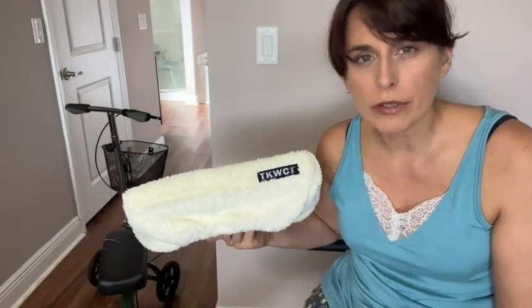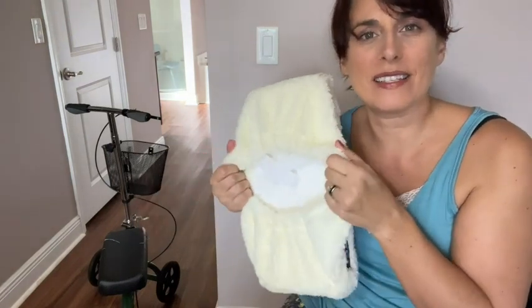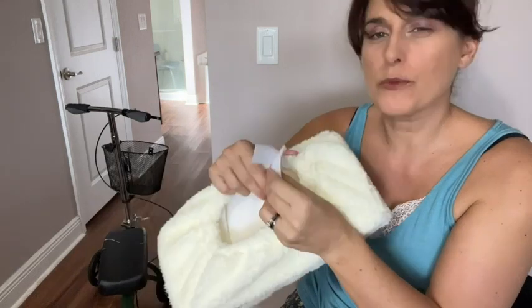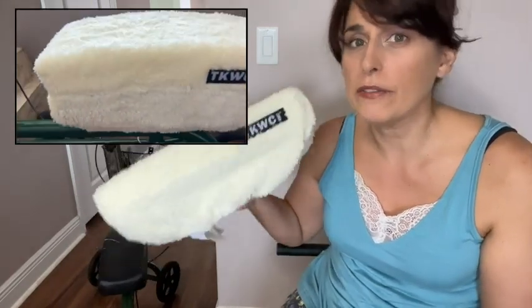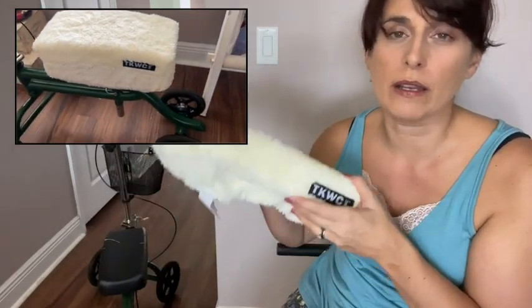I was concerned while using the knee scooter that I wouldn't feel as stable when I added an extra cushion on top. I'm happy to say that because this is such a snug fit and it comes with those extra velcro pieces, I felt very secure and stable while operating the knee scooter even with this extra cushion and cover on top.